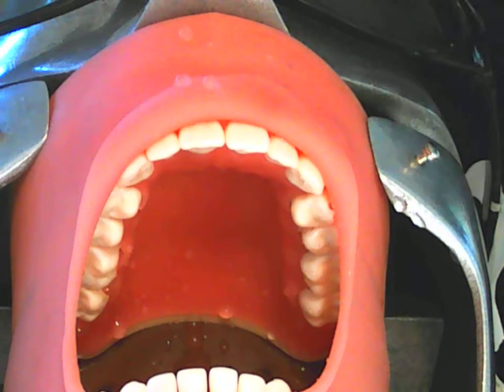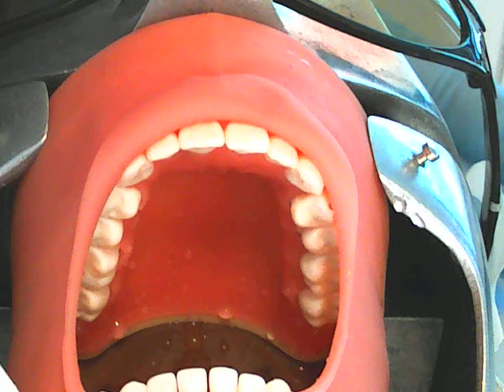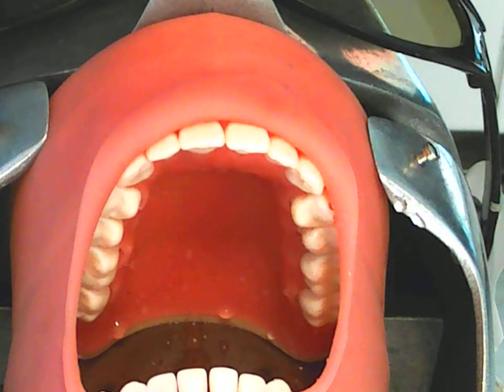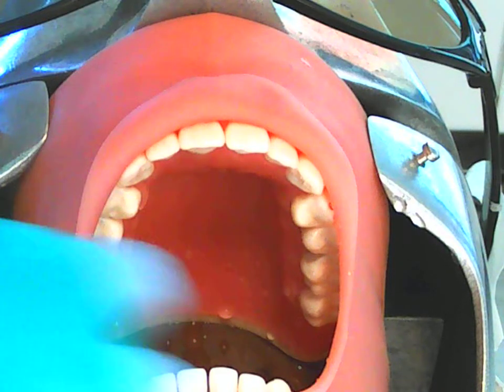And you would provide a tissue to the client if there was any splashing, which there a little bit was, and you may close and relax your mouth. While the client is just relaxing, you're going to remove the dental dam off the frame and ensure that there hasn't been any tears in your dental dam by laying it again on a flat surface, and the hole looks intact.